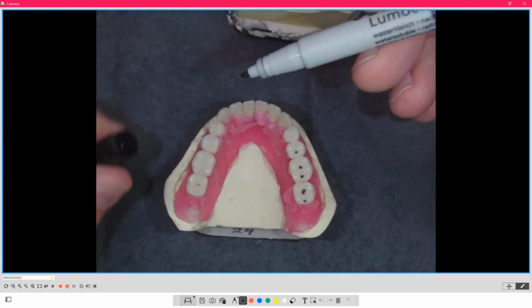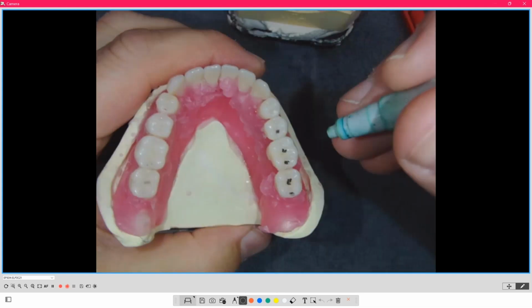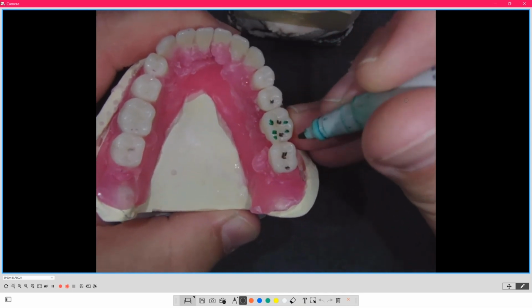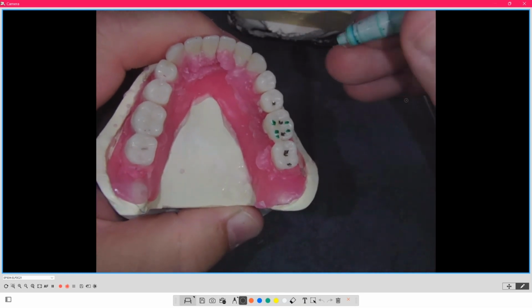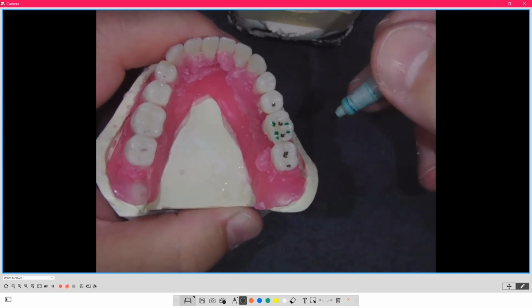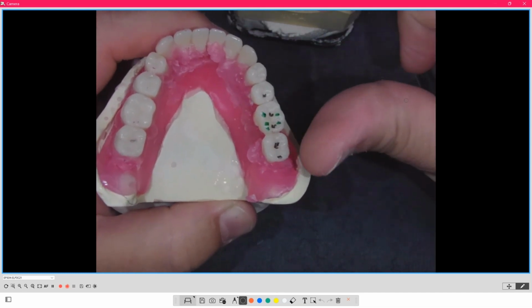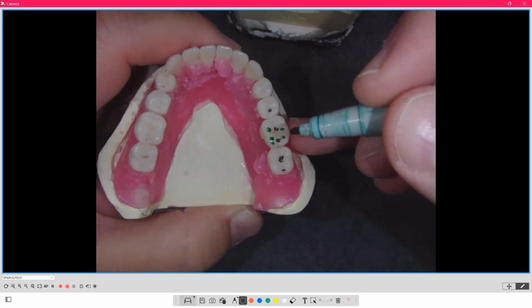And then what we want to watch for is when the patient chews, and the calibration of this is you just don't want the denture teeth to hit on these guiding planes and slide in. So everyone has a chew cycle. Everyone has an ability and how they chew their food. It's a unique cycle. We walk in a unique pattern. We talk in a unique pattern. We have a fingerprint. We have a retinal scan. These are unique to us.